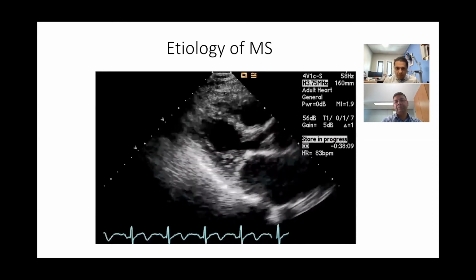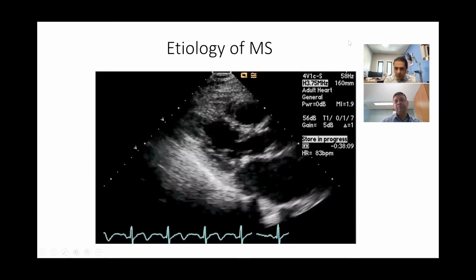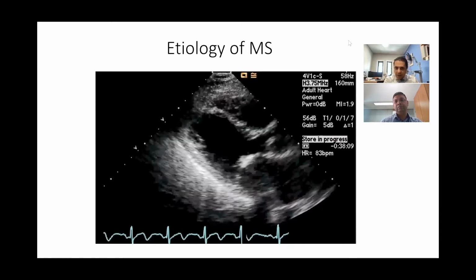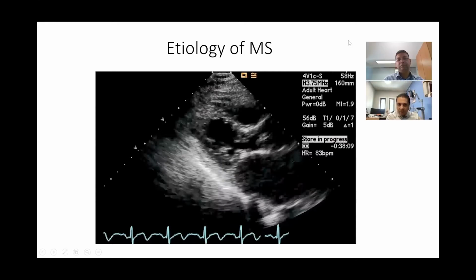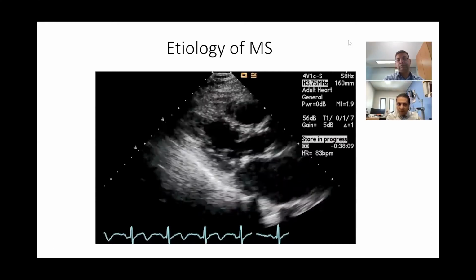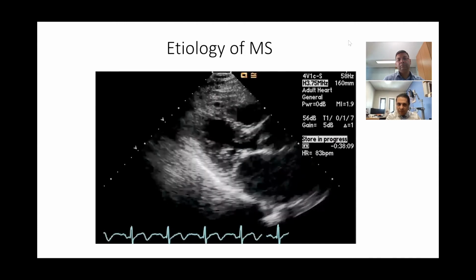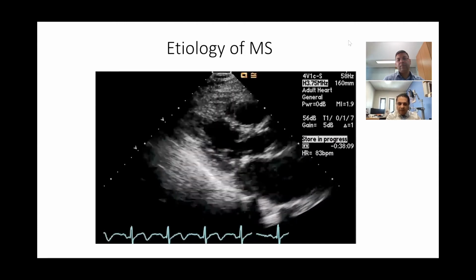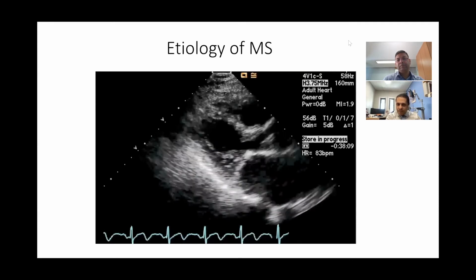So the mitral valve doesn't look like it's opening adequately. It's heavily calcified, and definitely the outlet, at the leaflet level, is quite diminished. So I'd expect an element of stenosis here, given that the left ventricular function is intact. So definitely it's valvular pathology.